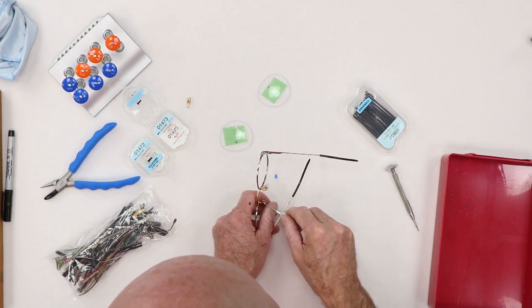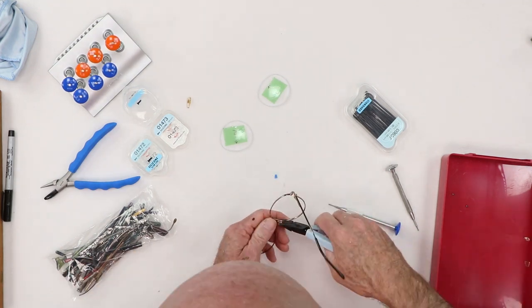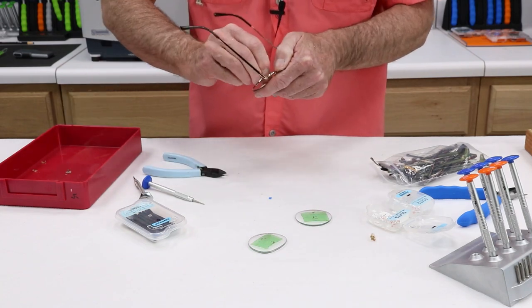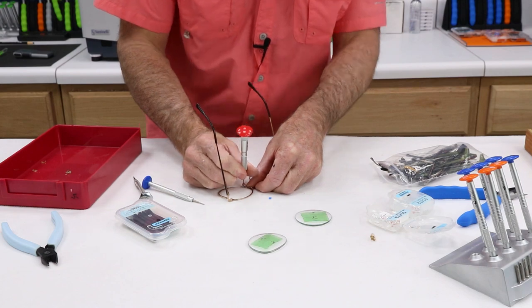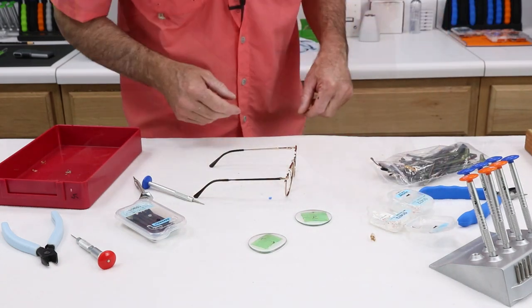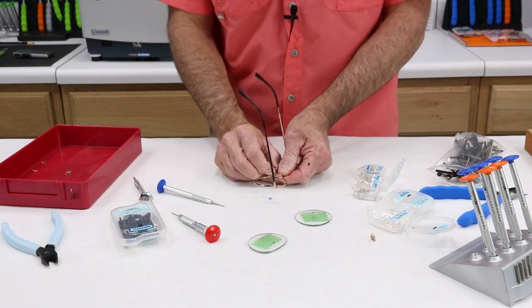I honestly do not even know what happened on this other side, but it is ugly. Let's go ahead and cut that off. Do you believe this is actually just going to work? I can't. And that tightened down just fine. So we got ourselves some beautiful, nice new nose pads on there as well.